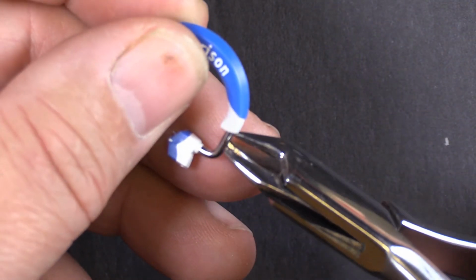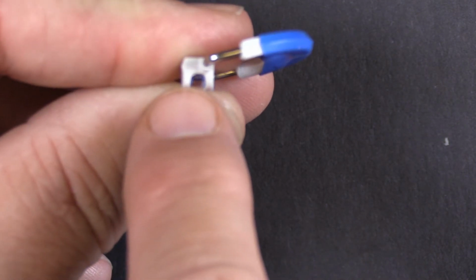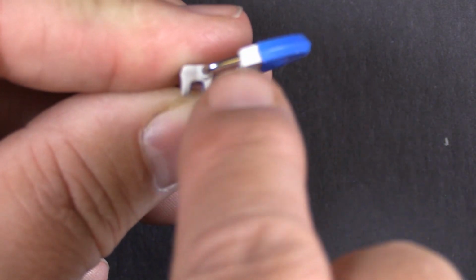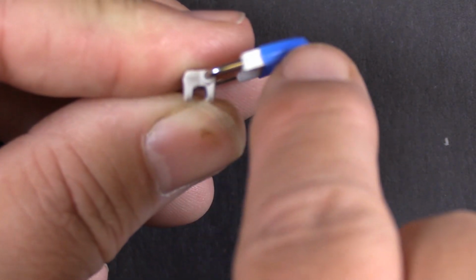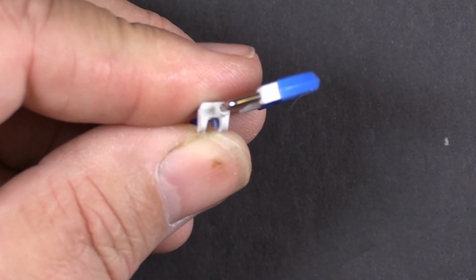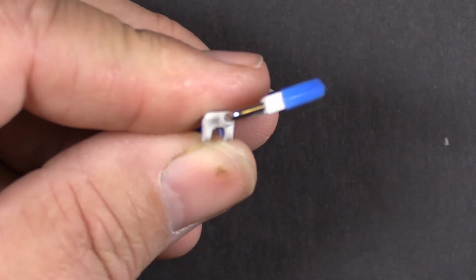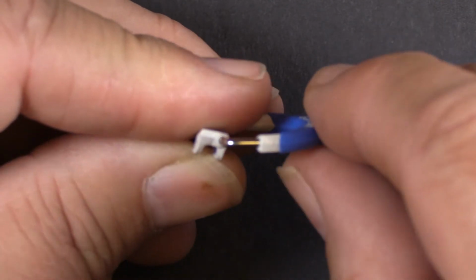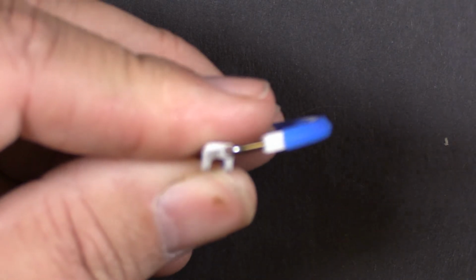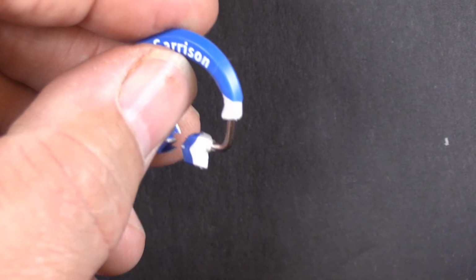But a 3-prong plier, this has about a 15-degree angle. Like the gold ring we were looking at, this was a 90-degree angle here. This is a plus 15, so we're at 105 degrees right here. Most of the time that's enough, and if you're doing an upper, or like the model that we were just looking at, that's plenty for that. And if you had it any steeper, now you've got this ring sticking up in the way on all your other cases. So we're trying to split the hairs on that a little bit, and sometimes it works and sometimes it doesn't.